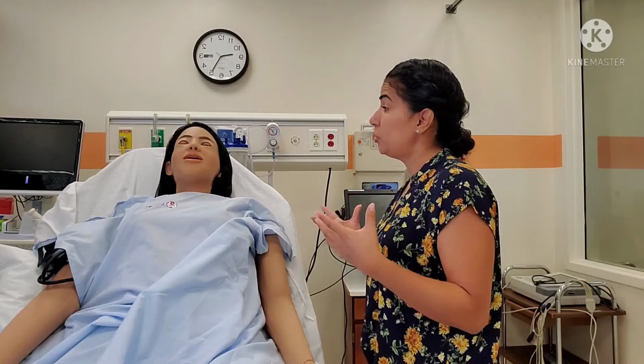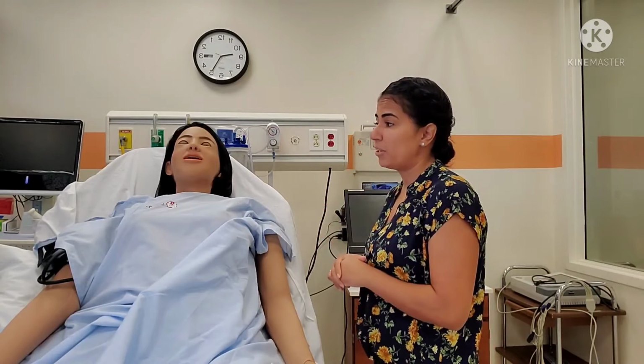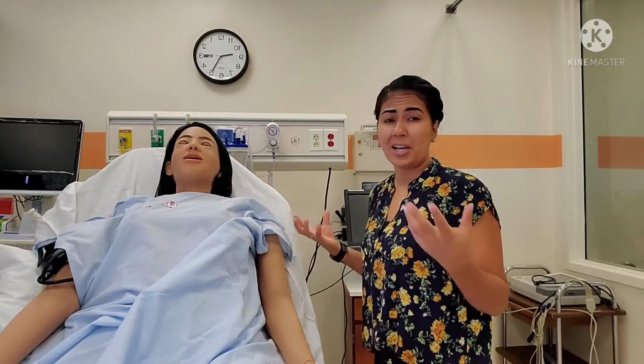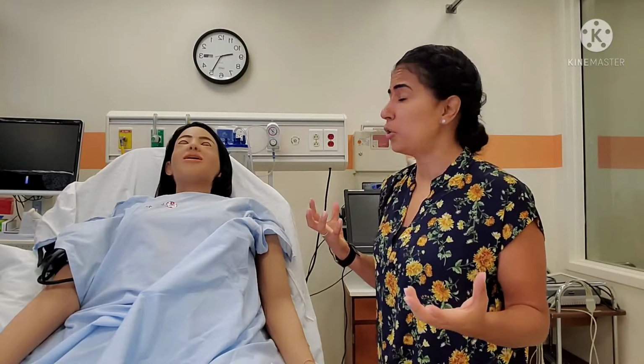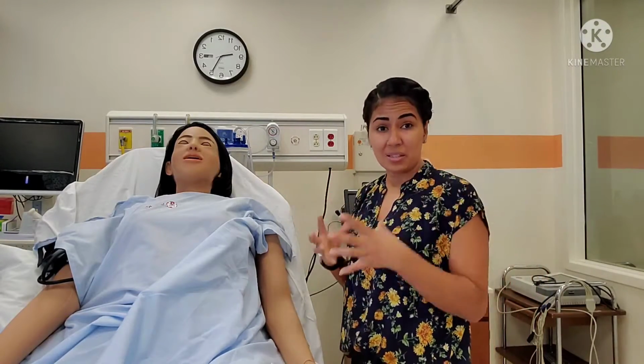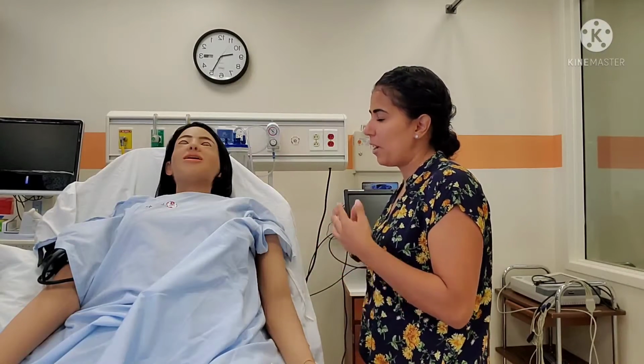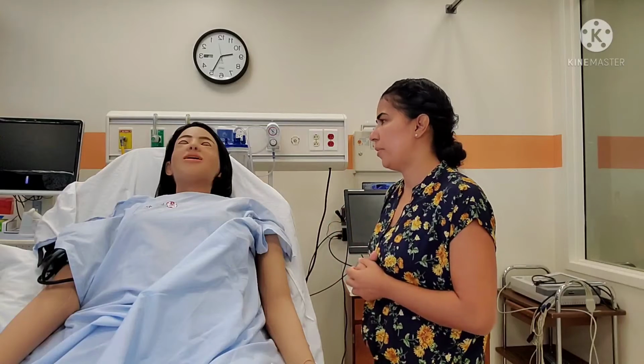What we want to do is make sure that we manage your pain effectively, because when a patient is in pain with a chest tube, you're not going to be breathing as effectively as we want you to. And remember that we want this lung to re-expand. So we're going to want to control that pain, okay? If you're having pain, just remember you have your call bell you can ring.